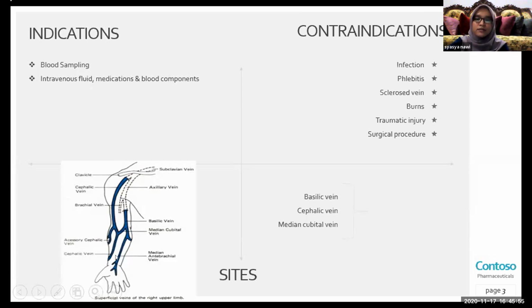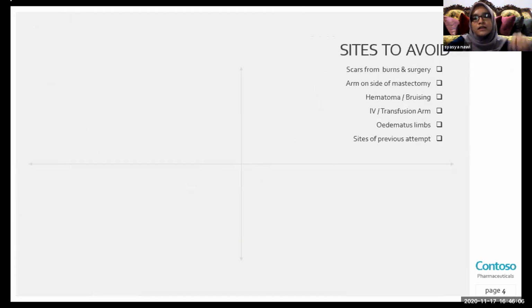Why these 3 veins? Because they are visible, easy to palpate, and less painful to the patient.